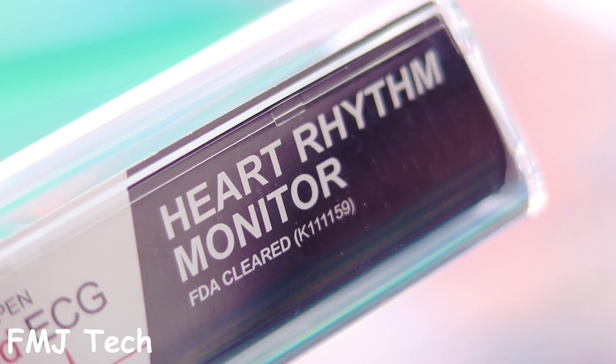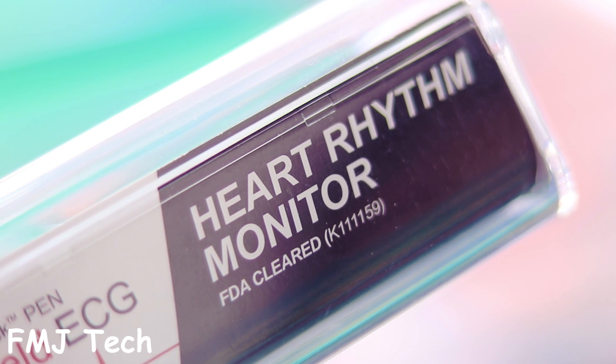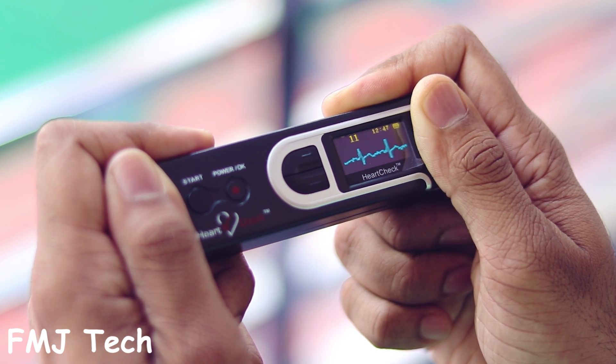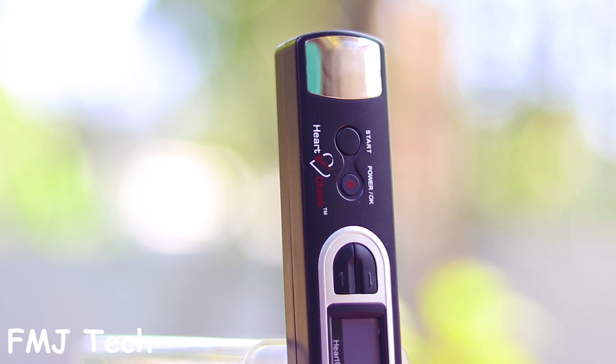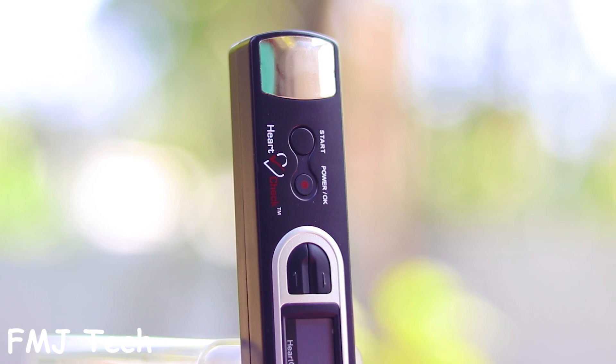This is the only licensed handheld ECG device in the market cleared by FDA for consumer use — a device that could help in millions of life-saving diagnoses if used properly at the correct time. It's all possible with this revolutionary gadget: the HeartCheck Pen handheld ECG device.